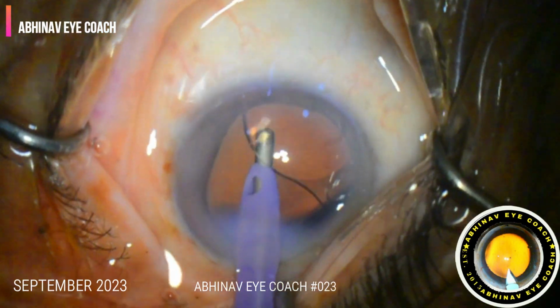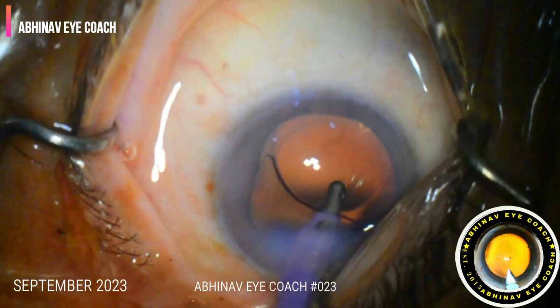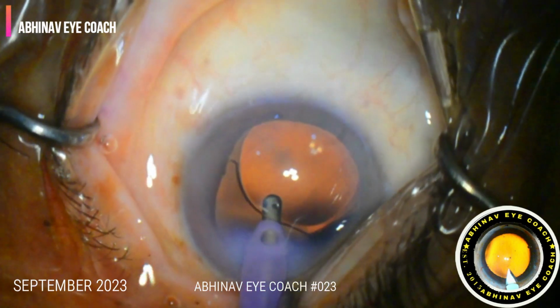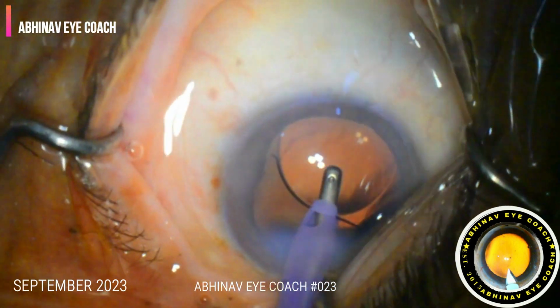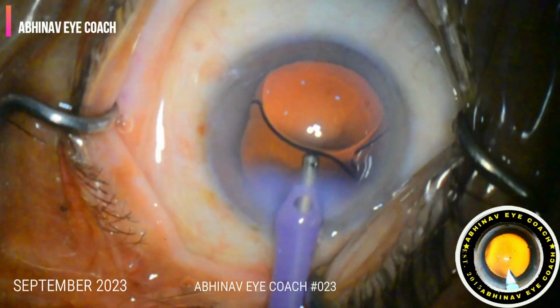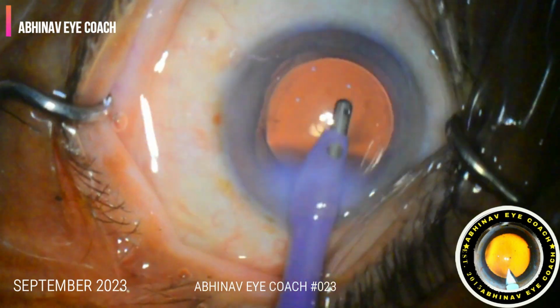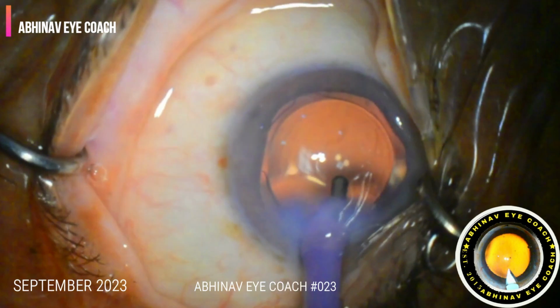We are going behind the IOL. One should know these maneuvers, how to go behind the IOL in each and every case without dislocating or bringing the lens out of the bag. So these maneuvers should be very gentle. This significantly reduces the postoperative inflammation and raised intraocular pressure.